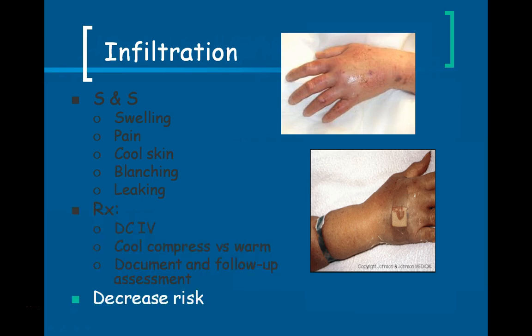And infiltration is something that can happen simply because the patient has an IV in. Like I said, it's a foreign body, and the area around the insertion into the vein can dilate, or the cells can get irritated and it can leak between the cells. So what we want to do is decrease the risk as much as we can.